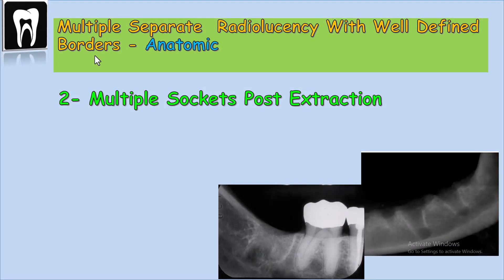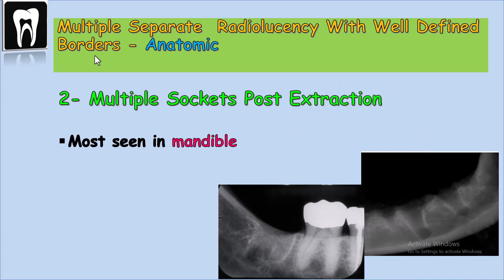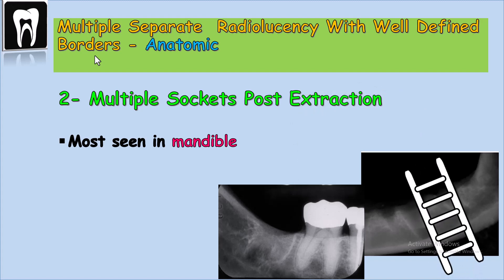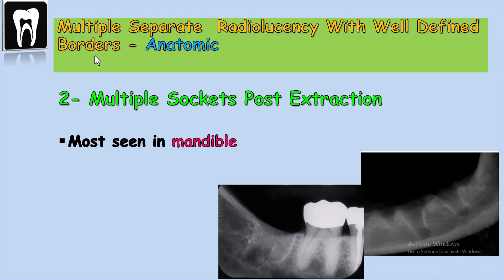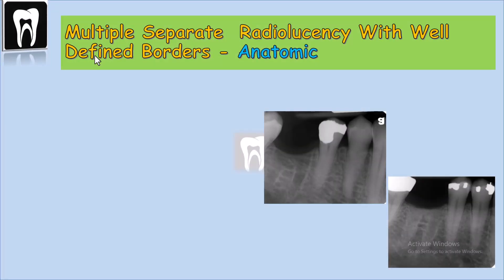Number two: multiple sockets post-extraction. In patients who had multiple teeth extracted at the same time, this is how it appears in the radiograph. Mostly seen in the mandible because in the maxilla, the trabecular pattern — which is like a web — covers the empty socket. But in the mandible, we have less trabecula with a ladder appearance, so the socket is much more obvious. The healing process starts from the lamina dura or the lateral part of the socket towards the center, and it takes time to heal.